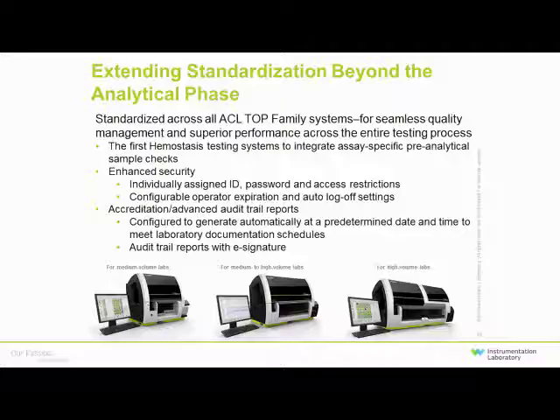Okay, so along with the pre-analytical features, there are also some other features which happen in your post-analytical, which haven't been mentioned before, and they're listed above. So you have your current testing for your pre-analytical checks, but then you also have enhanced security, which allows the individual to assign an ID, password, and access restrictions, configurable operator, expiration, and log-off settings.